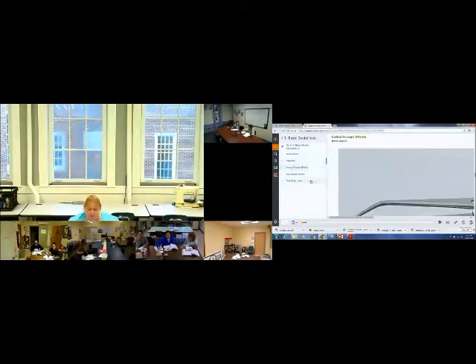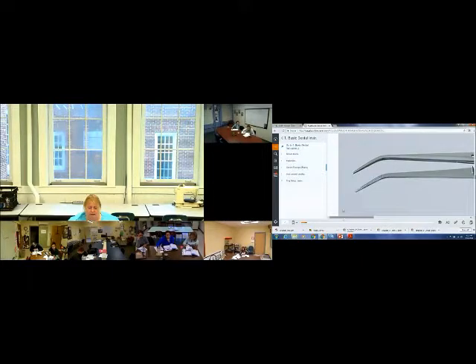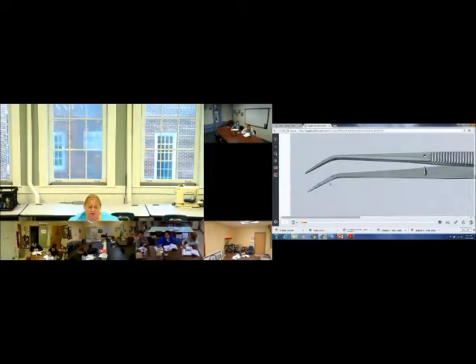is cotton plier, or as some dentists call it, the college plier. So cotton or college is used interchangeably for this. Sometimes it depends on where the dentist went to school. So if a doc says, I need the college plier, don't freak out, just hand him the cotton plier. And this is a pretty familiar instrument too, because it looks like tweezers, doesn't it?